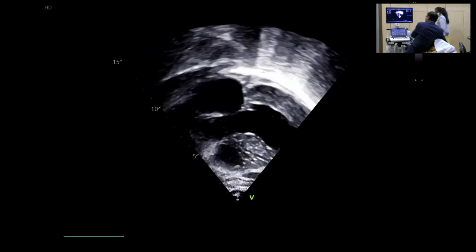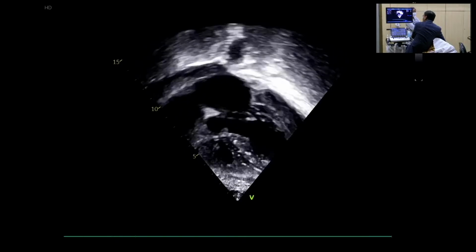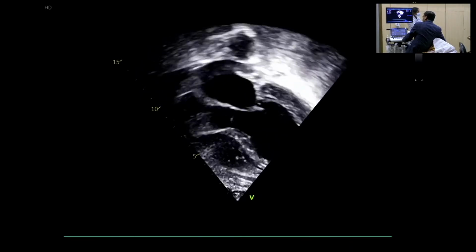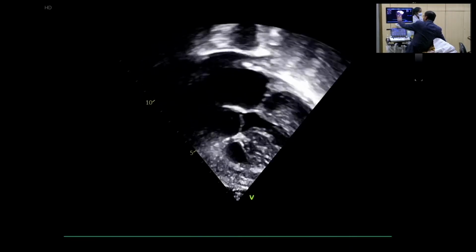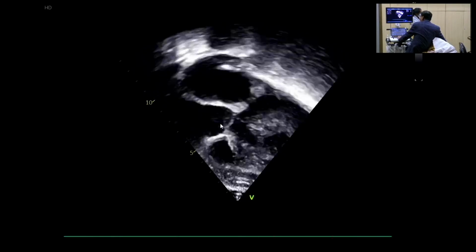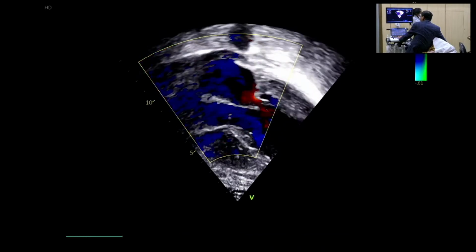That's why I'm looking at the mitral valve. I'm trying to see whether we have a normal mitral valve or not. Membrane, subaortic membrane, supravalvular membrane. So mitral valve is okay. I am seeing the LVOT now. Everyone is going with me now. This is the LVOT. I am seeing the aortic valve. I feel this is not normal, the aortic valve. Let us see in the other views.